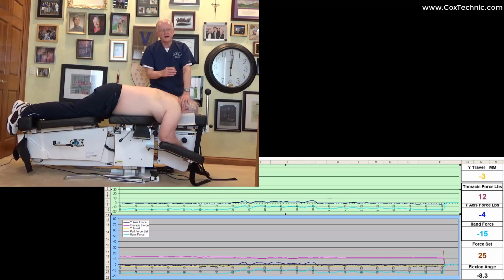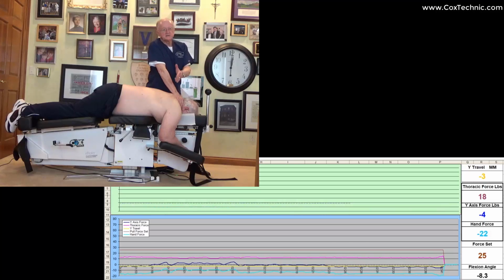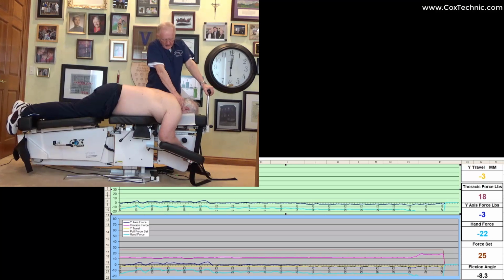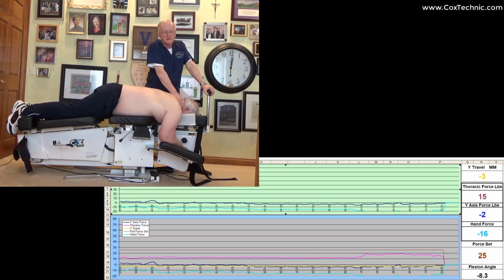If you want to find the level of somatic dysfunction, disc herniation, inflammatory exudate, just do foramen magnum pump. I use it as a diagnostic and a tolerance test both. As I apply this, and my hand is lifting cephalad, as I apply the same force with the tiller bar, I ask, do you feel any pain anywhere in your spine?